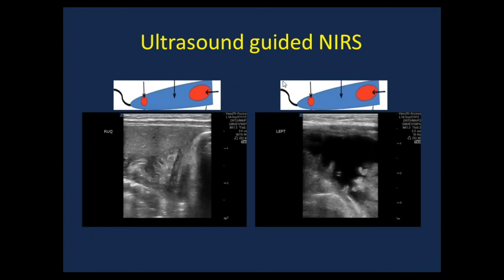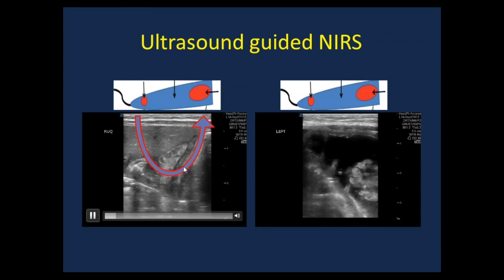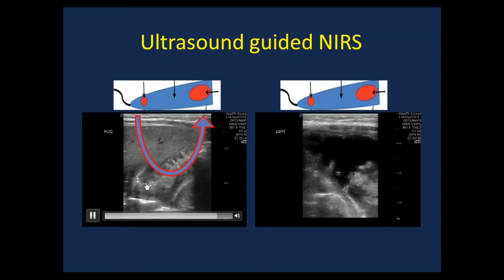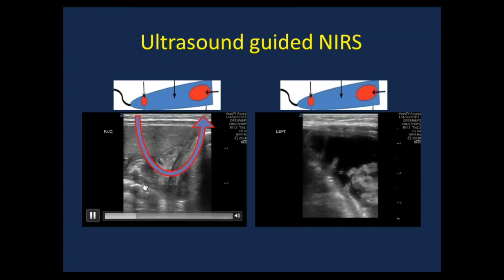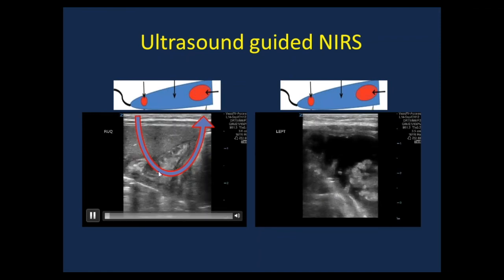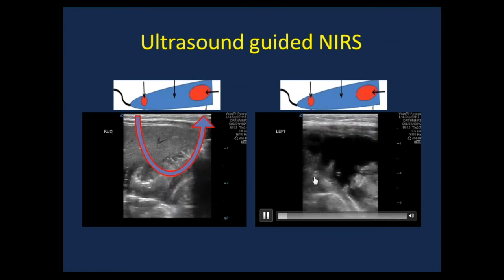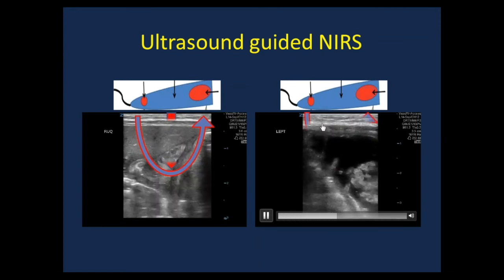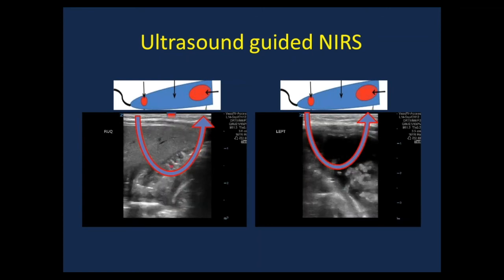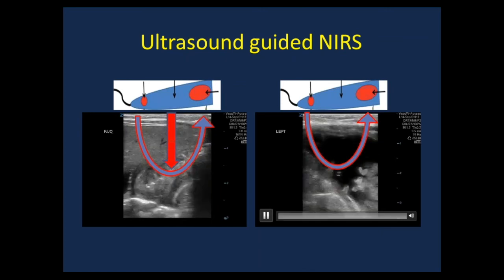Just to show you in this slide how we integrate ultrasound and NIRS. For example, in this example, I'm evaluating the intestine by NIRS and ultrasound at the same time. That's a new technique that we are using, instead of relying on X-ray for assessment of NEC or compromised intestinal performance. In this video here, you have NIRS applied, and the NIRS wave is passing through fluid in the colon, and in this case will give you an unreliable number. That's one of the limitations of NIRS.